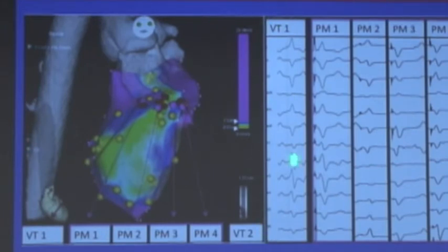For the electrophysiologists in the audience, here's a couple pace maps close to it. And in fact, this pace map, it's not 12 for 12, but it's pretty close. Usually in the pigs, we get 10 or 11 for 12, and that would be the best site.